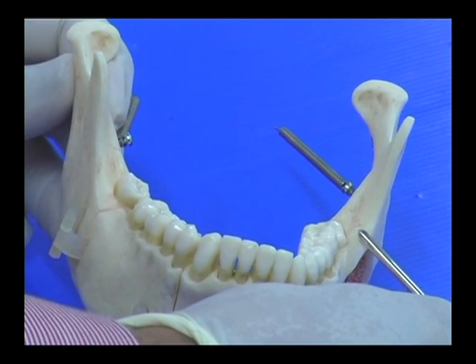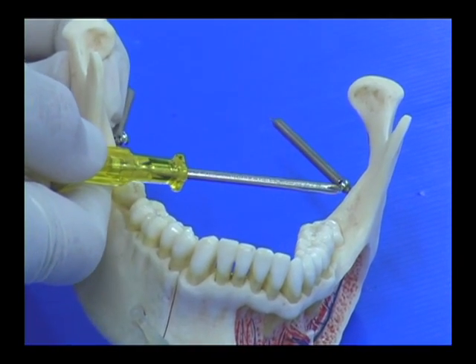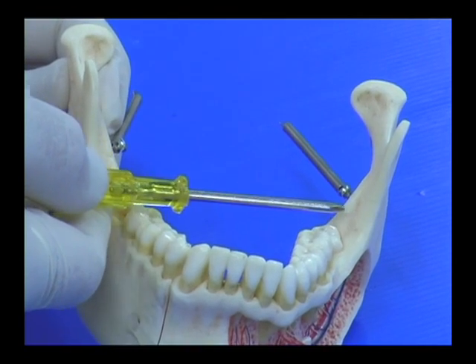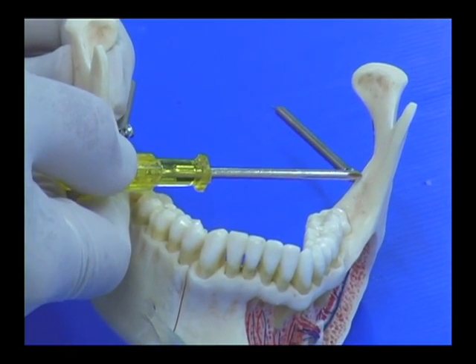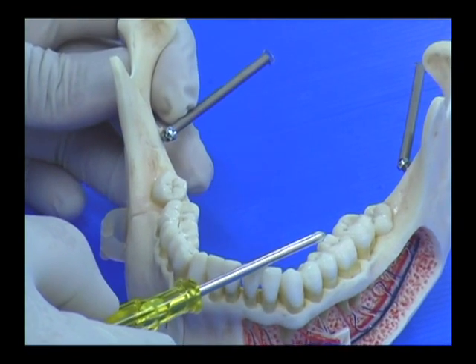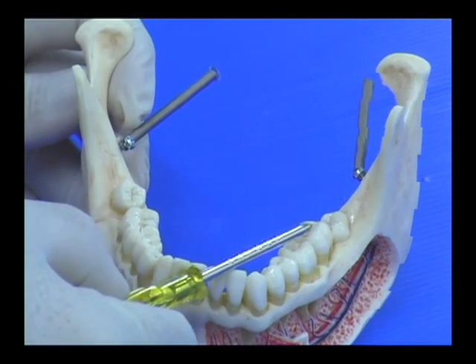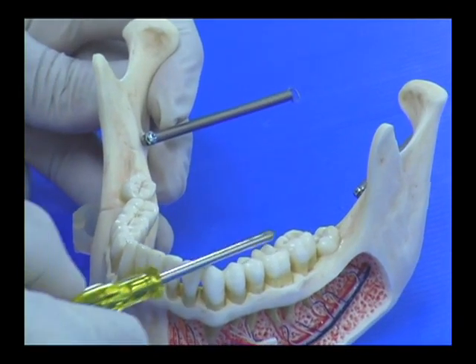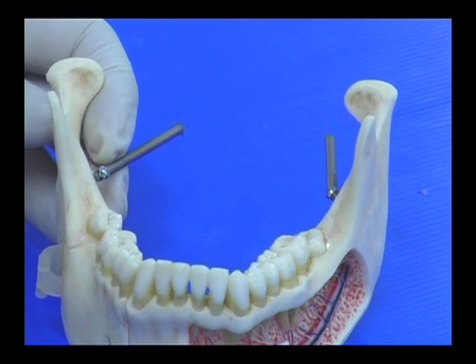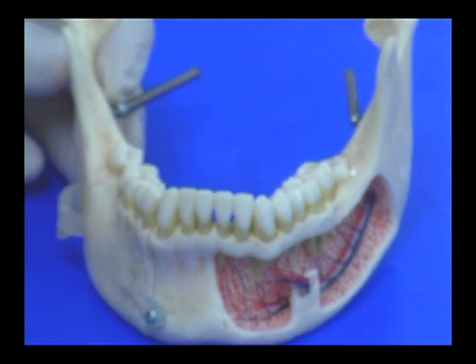Another important landmark is the internal oblique ridge, which is slightly medial to the coronoid process. This is the internal oblique ridge. The other important landmark for inferior alveolar nerve block is the occlusal plane of the teeth. These landmarks are used for the administration of the inferior alveolar nerve block.